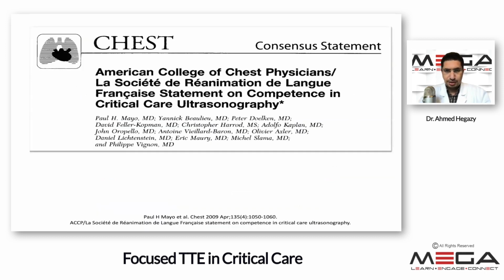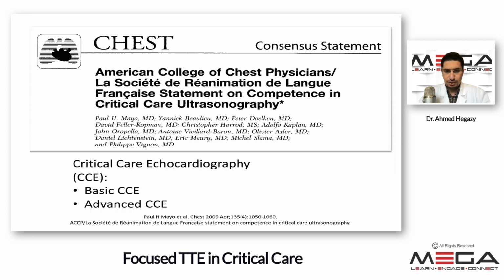This consensus statement is the statement that we have adopted here in Canada for the most part, and there's also a Canadian version of it. But this statement was put forward by the American College of Chest Physicians in the year 2009, led by Dr. Paul Mayo and his colleagues. And it broke down critical care echocardiography into two domains: basic critical care echocardiography and advanced critical care echocardiography. Today, we'll try to, as much as possible, cover basic critical care echocardiography.